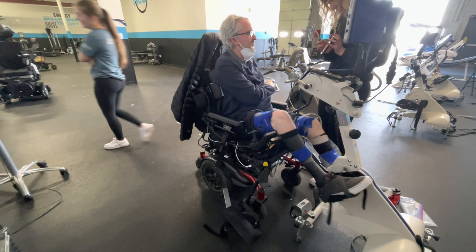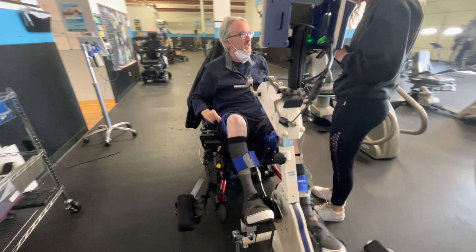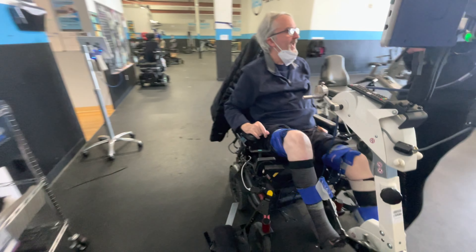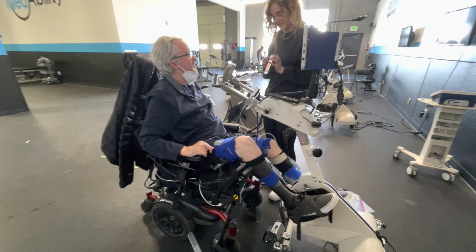This taxes their cardiovascular system as they push into resistance, requiring blood flow into the paralyzed muscles, while also maintaining bone mineral density, maintaining muscle mass in general, and helping to lessen the load on their kidneys and liver. Overall it's a good way of enriching the environment of paralyzed tissues so we can get blood flow and nutrients distributed across the board.